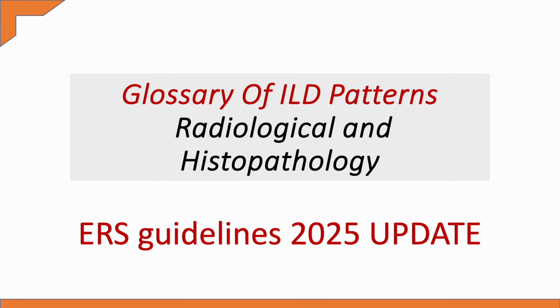I am Dr. Anshu Maneja Arora, and in my previous video, I discussed the latest ERS guidelines on IIPs. This was a revolutionary guideline statement that has really changed the concept in which we are noting various patterns in ILDs. So, this video is one of a kind, where I will be taking examples directly from the guideline paper so that you can essentially compare the various patterns you see in your clinical practice with the standard ones mentioned in the literature.